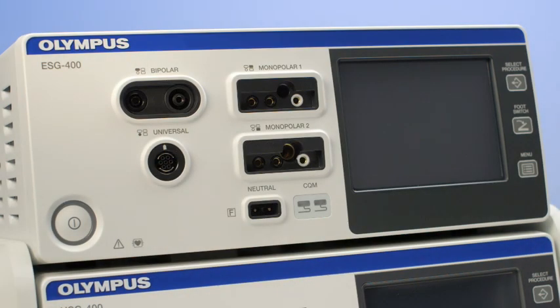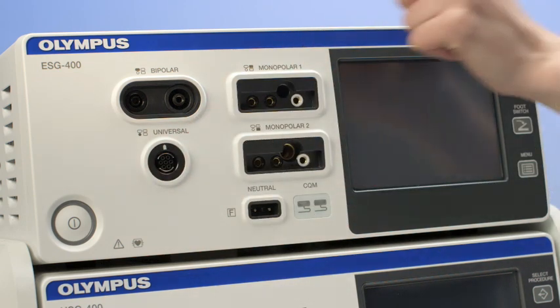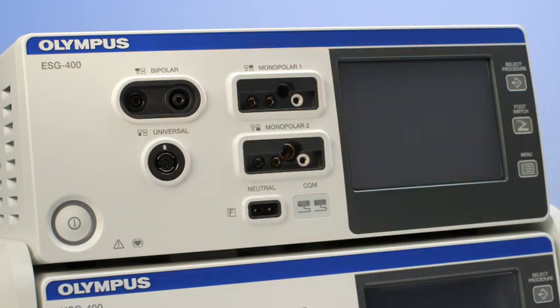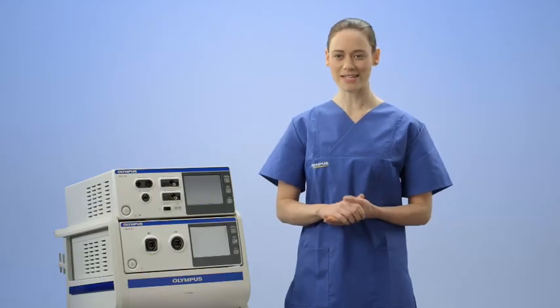The control panel of the ESG400 is divided into four main areas: the power switch; the connection area for various instruments and patient plates; the operation area with a graphical user interface which allows you to select power and other settings; and quick access buttons which allow you to change the system settings of the generator. To activate the generator, simply press the power button.